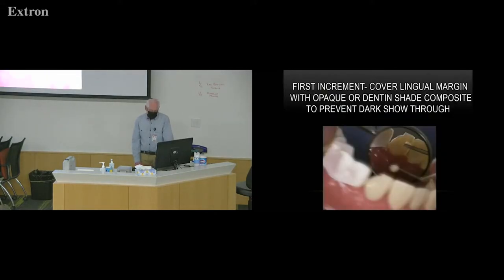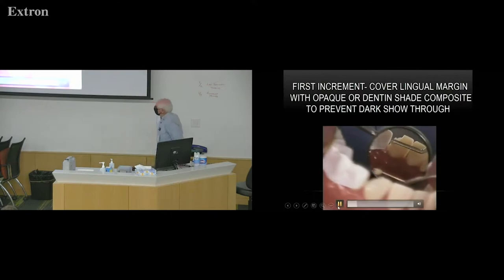Okay. Take some composite, and we're going to be using the opaque shade. Now, we probably won't be doing this in the lab, but just remember, on the lingual you always want to use something that won't let the darkness show through, the back of the mouth. But take your plastic instrument and cover the lingual margin.